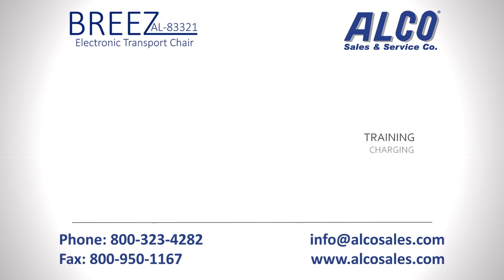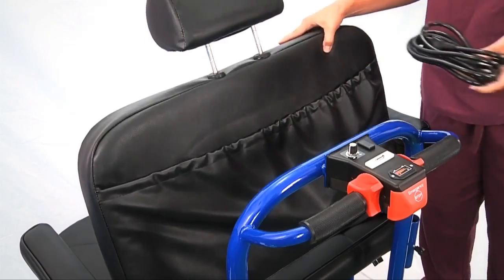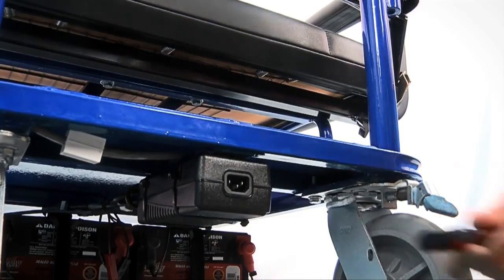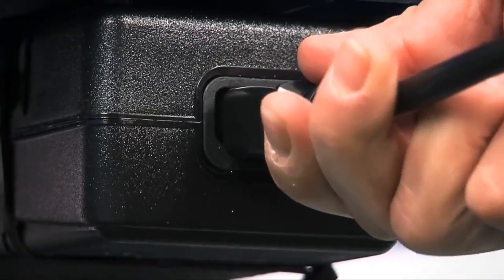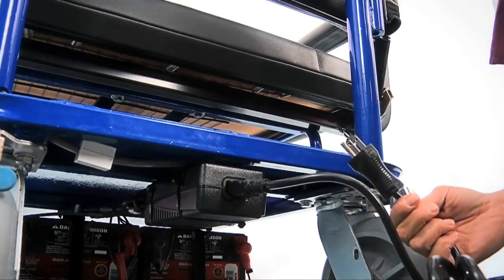When the battery charge indicator displays only red and yellow lights, it is time to recharge the Breeze. To charge, remove the power cord from the pouch on the back of the seat. Locate the battery charger under the back of the frame. Then insert the female end of the power cord into the charger and the male end of the cord into a standard AC outlet.